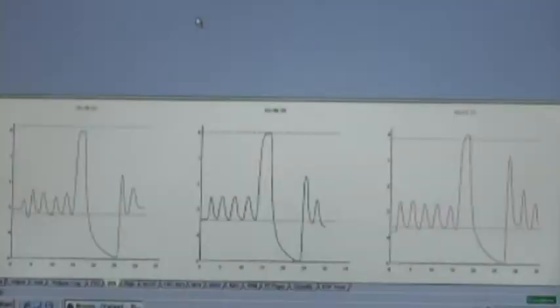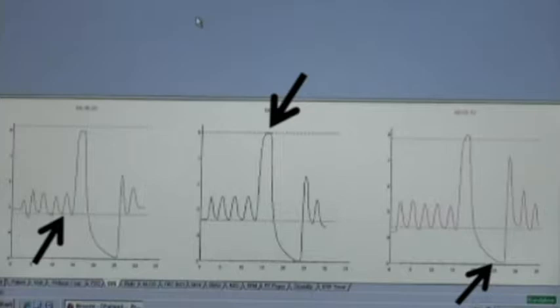So when we're doing the PFTs, it's important to make sure that we do 3 of them. We get a good baseline in all 3. We see evidence of a good inspiratory plateau and expiratory plateau on them, and that there are no coughs or sudden changes in flow during the test. The patient hasn't had any coughing spasms or anything like that. In this one, we're probably blowing out a little faster than we needed to, and the patient could have probably blown out a little slower, but these look fine and would meet our American Thoracic Society criteria.